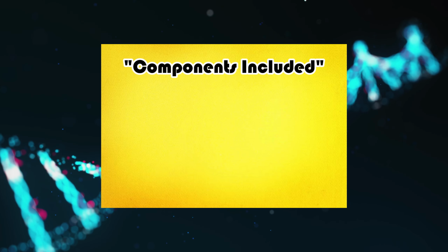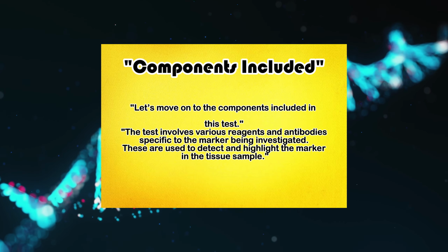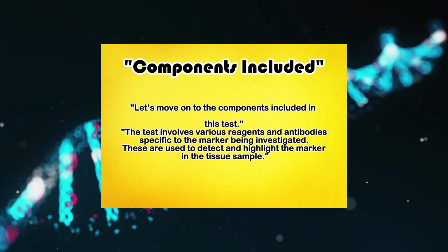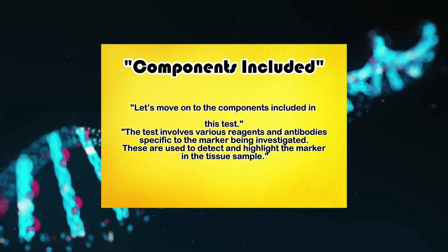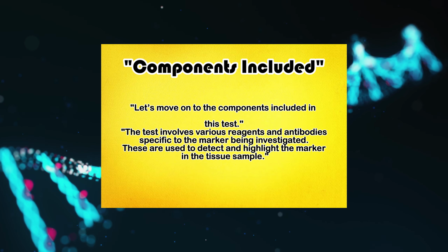Components included. Let's move on to the components included in this test. The test involves various reagents and antibodies specific to the marker being investigated. These are used to detect and highlight the marker in the tissue sample.